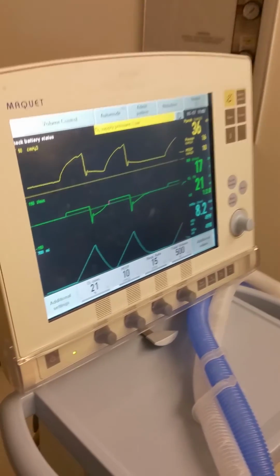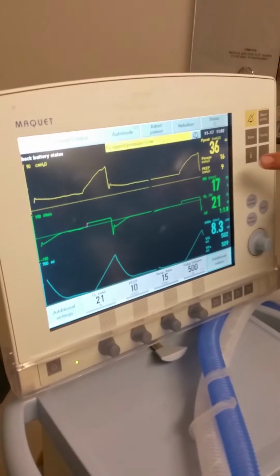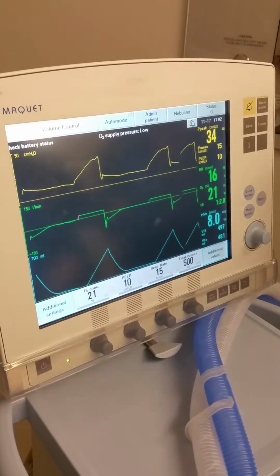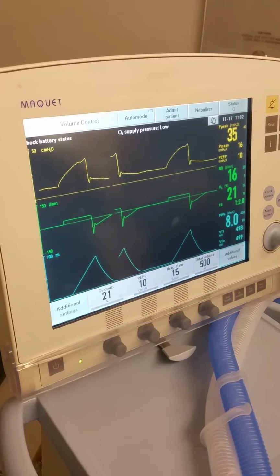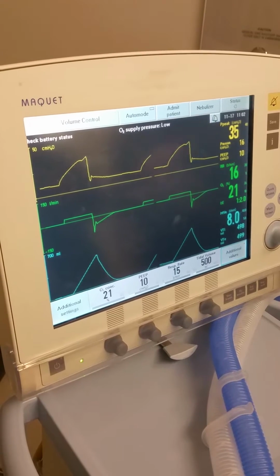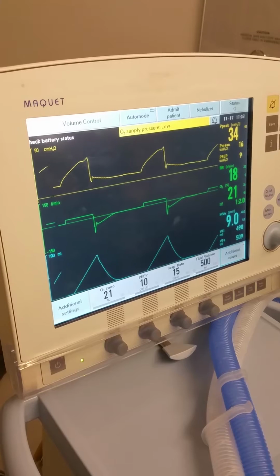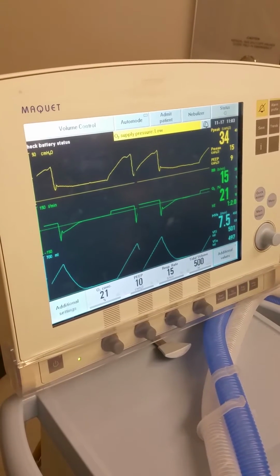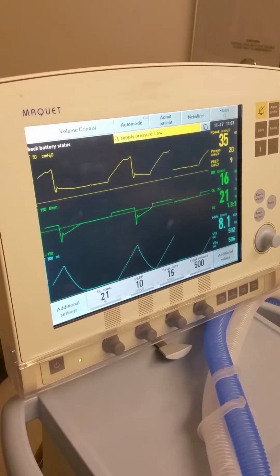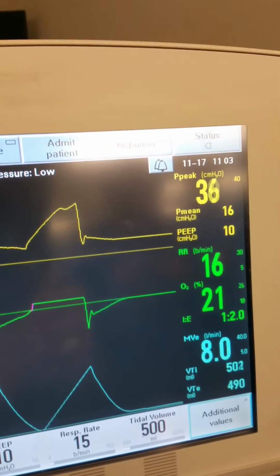Karina. Oh. So one of the things you want to be aware of, remember our peak pressures that we're getting are about 34. So we want to be a little bit below that, right? Obviously we want to be at a P high of about 30. If our peak pressures are already high and we're getting that volume, you know that when we go over to Bilevel, we're still going to need probably a good P high of at least 30. We want to stay below that. Our PowerPoint said use as high as 35, but I would start out a little lower. Around 30? Yeah. And see where you're going to be.